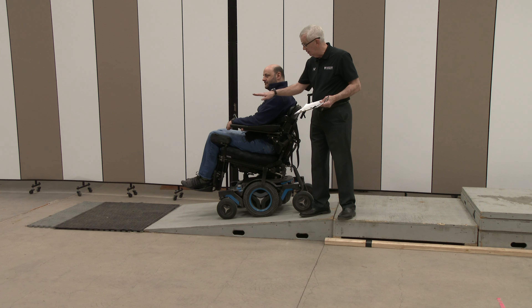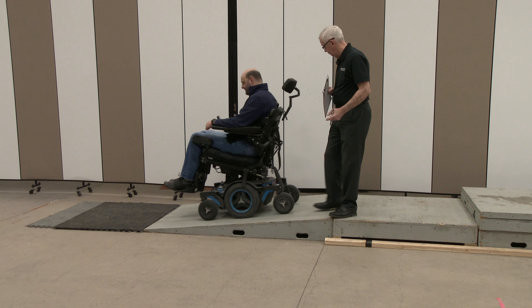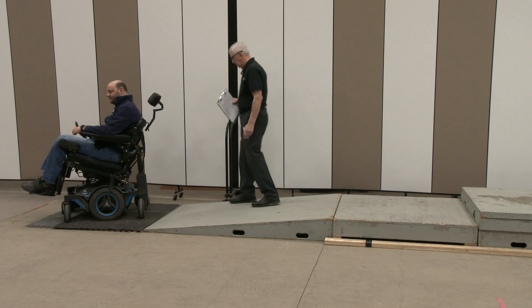The footplates aren't going to bottom out when you reach the bottom either. So if you could just carry on the rest of the way — great, thank you.